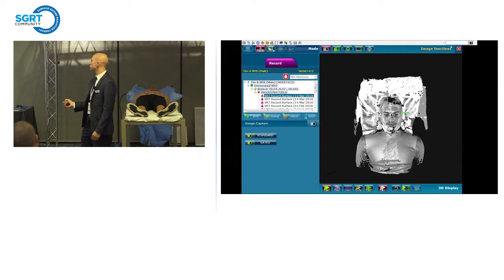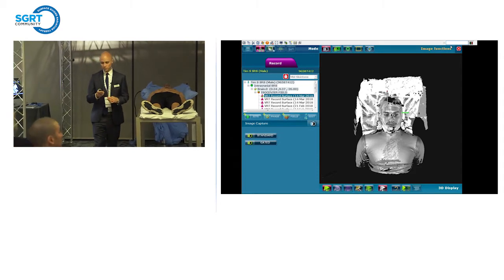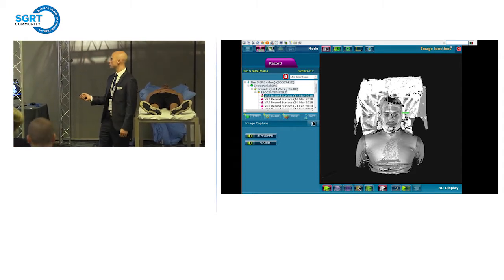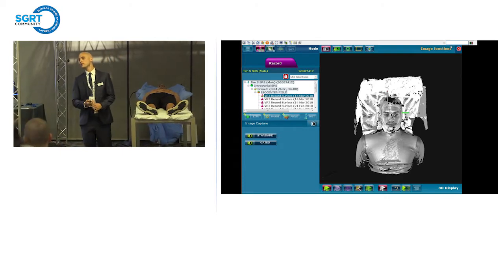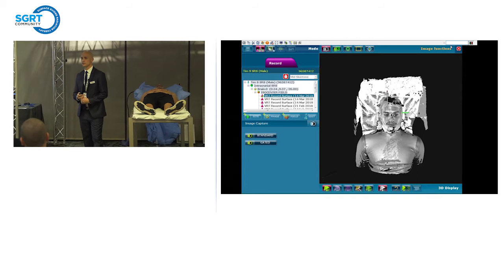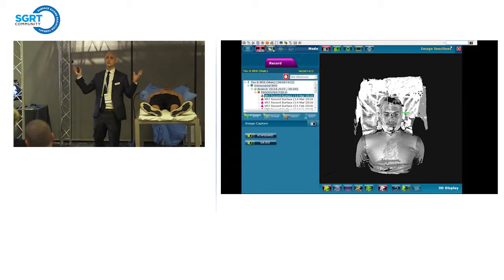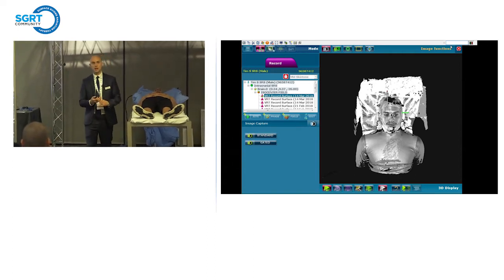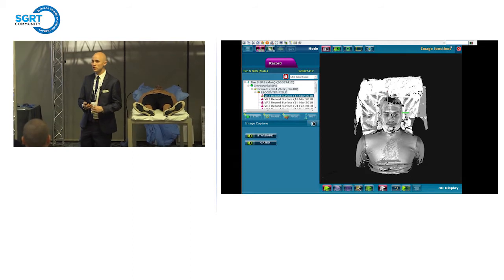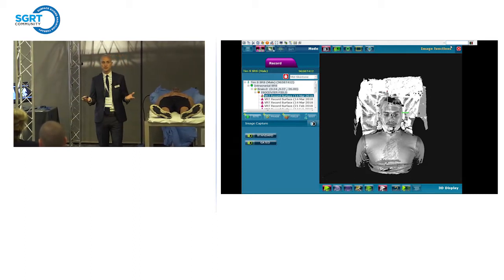Underneath those numbers, we have our ISO center field, which houses all of our reference surfaces. I just want to mention briefly, the reference surfaces that you see here say VRT as their header. There are two different headers that we will see within this product. The first one is DICOM, the second one is VRT. VRT signifies we took a reference capture using the Vision RT cameras, and DICOM signifies it came from your CT sim.